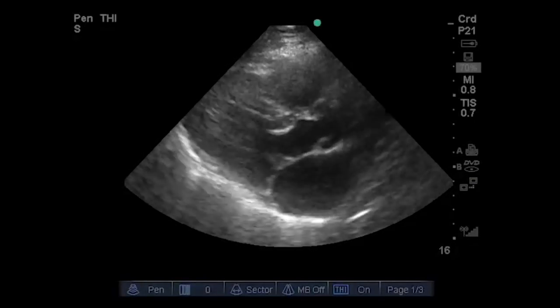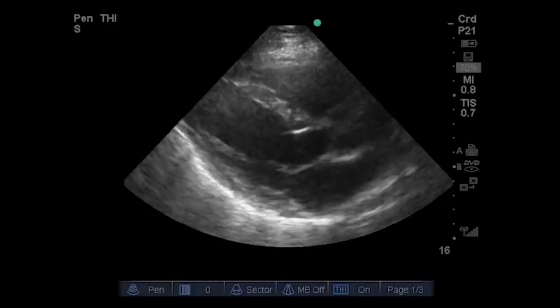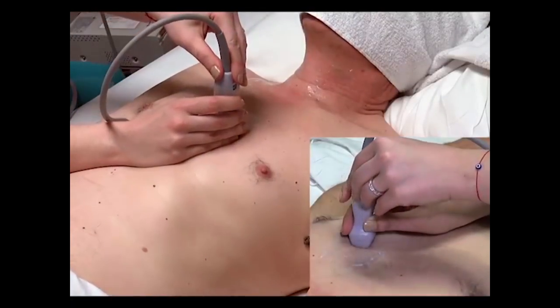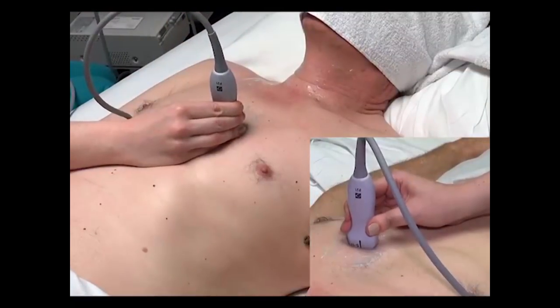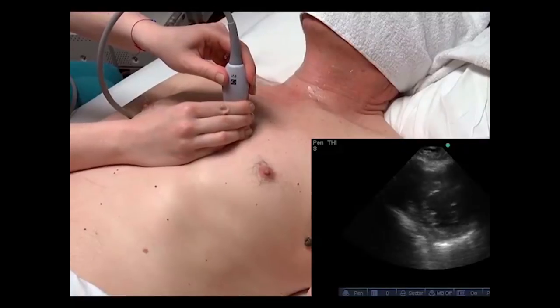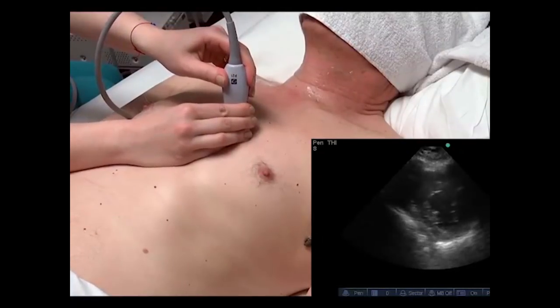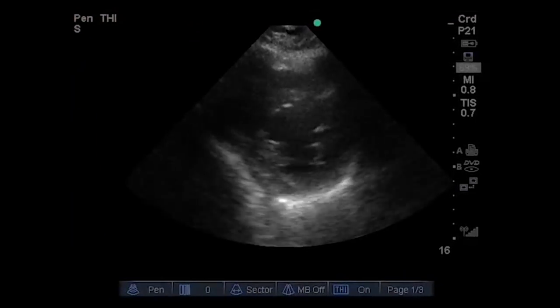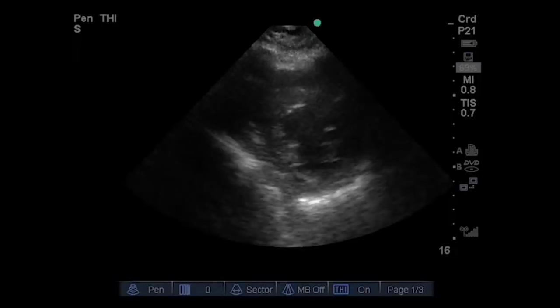The second mandatory view for the goal-directed image set would be the parasternal short-axis view. The examiner rotates the probe from the parasternal long position to the short position, 90 degrees clockwise, without moving, angling, or tilting the probe, and they obtain an image of the left ventricle at the papillary muscle level. Once more, the depth is well set, the axis is appropriate at papillary muscle level, and the gain is also appropriate.